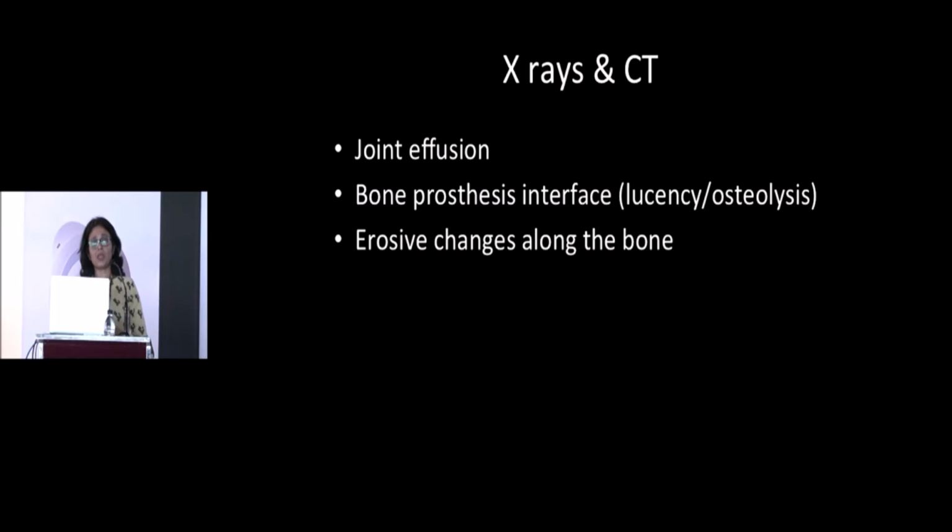X-rays are the mainstay in post-arthroplasty, and as we know, the number of knee replacements are increasing every day. We have a large number of patients undergoing them. So obviously, we have a large number of patients who, after an arthroplasty, would come back with some complaints, and we need to image them. One, to find out what's the cause of pain in these people. Second, will this patient require a revision surgery, which is quite a major thing. Somebody who's undergone a surgery, to tell them that you need a surgery again is not an easy task. So do we really need it?